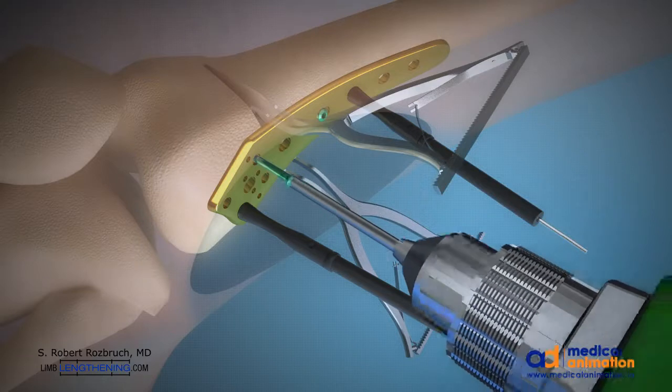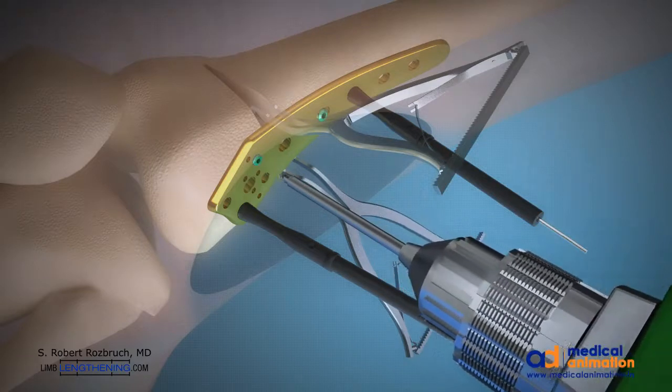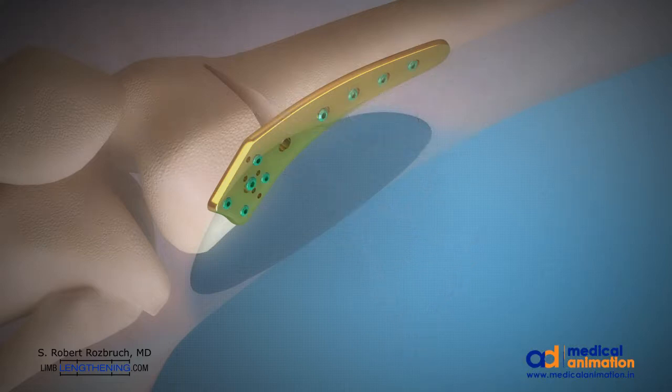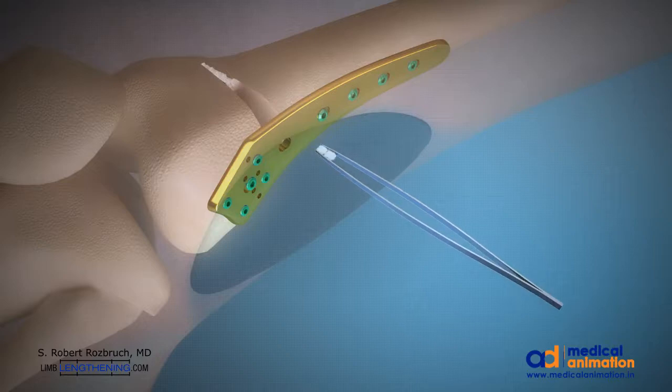Patients are allowed to bear partial weight and move their knee without difficulty. Casting and bracing is not necessary. The open wedge osteotomy is then filled with a synthetic bone graft — this area has high healing potential and autograft is not necessary.